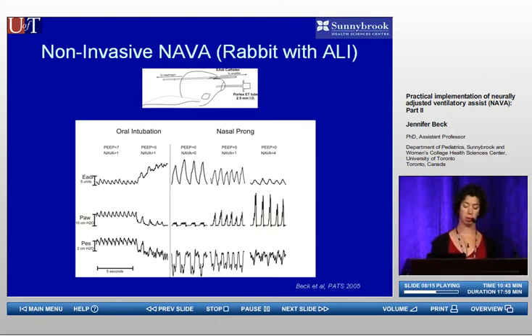What's interesting about the extubation here is that when we removed the PEEP the tonic activity increased, but when we removed the tube, we're actually liberating the upper airways, and now the muscles of the upper airways can participate in regulating FRC, and they can relieve the diaphragm from all that tonic activity.